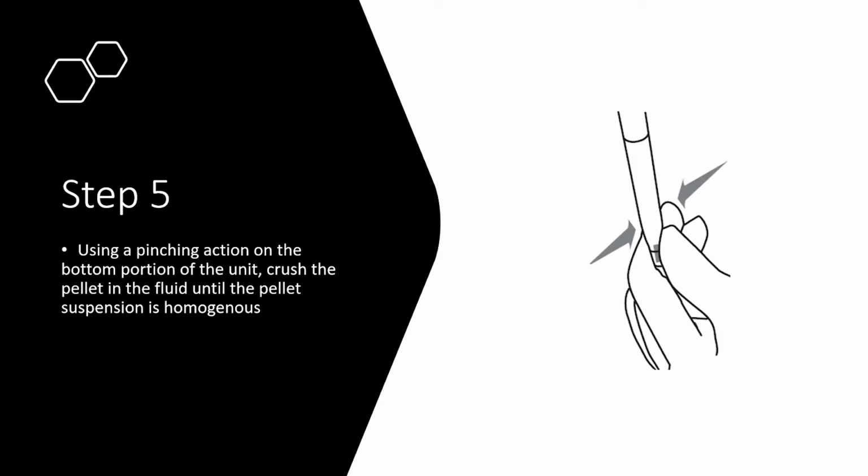At this stage, we don't have any recommendation whether that should be 30 seconds or minutes, but just for a sufficient amount of time that whenever you're pinching it between your thumb and finger, you can feel that the pellet is completely broken down.